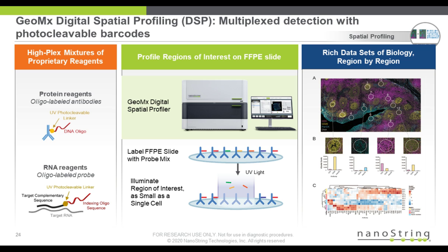Now, this is how GeoMx works. And in some of my talks, I actually have the slide that shows the original napkin where I scribbled out this idea. This was an idea I developed back in January of 2016. And it was all trying to address, how do you get quantitative high-plex protein and quantitative high-plex RNA information from fixed tissue, typical 5-micron tissue slices, FFPE tissue slices, that represents biobank sample, which is really the currency of translational research.